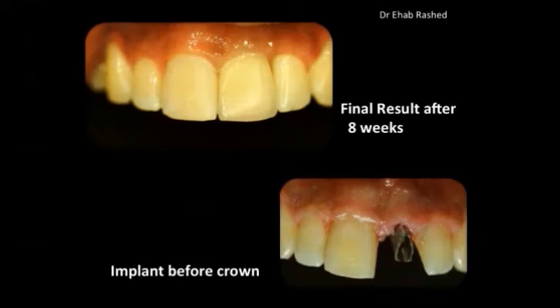Also, this is another case done by me. As you can see here, this guy came to me with a missing central incisor that he lost when he was a young guy due to a bicycle accident, and he went to an orthodontist who did his orthodontic treatment, and then he was referred to me by his orthodontist to do the implant for the missing central incisor.